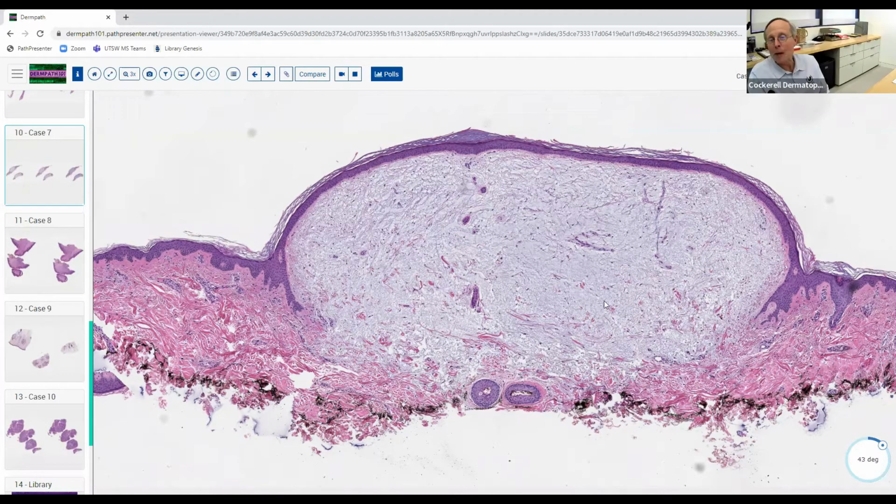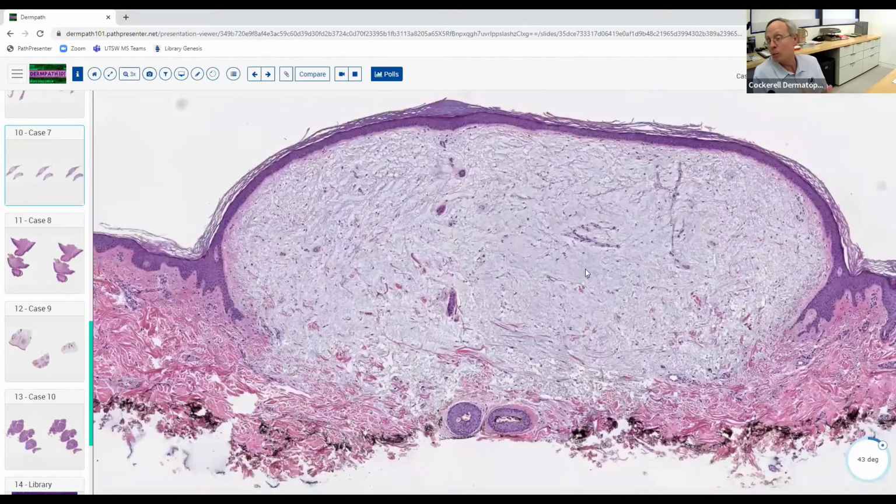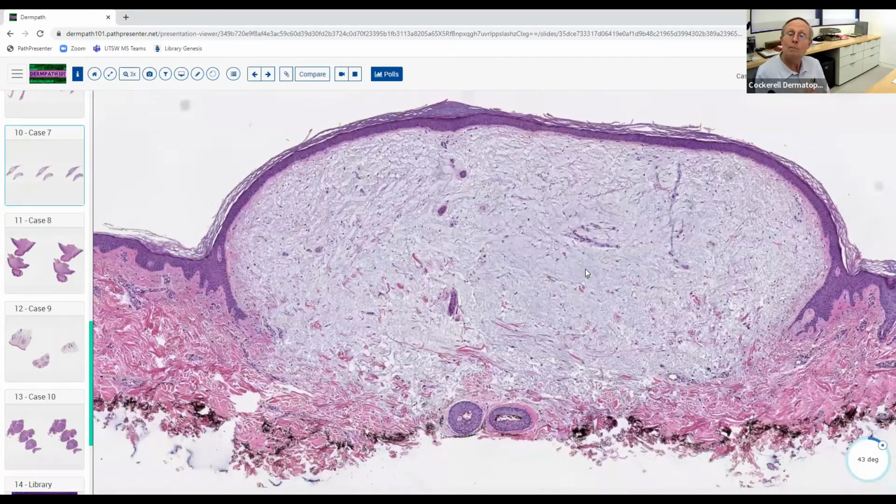There's mucin that's produced by cells like fibroblasts, mast cells and histiocytes. And then there's the epithelial mucin that we see produced in places like your salivary glands and mucus glands. So they're two different kinds of mucin. They both have a similar biochemical nature. Sialomucin is supposedly a little more acidic, with a lower pH than hyaluronic acid, which is probably what this mucin, this mucopolysaccharide, is that we're looking at here. But there are basically two types of mucin.